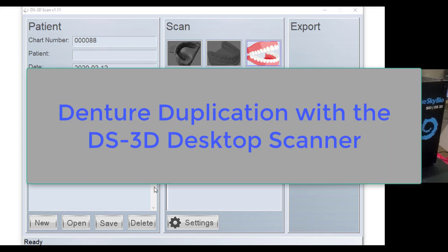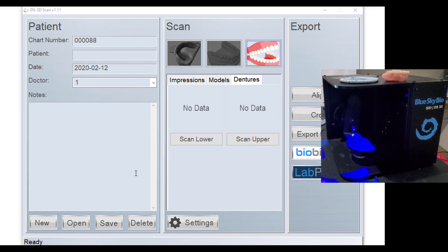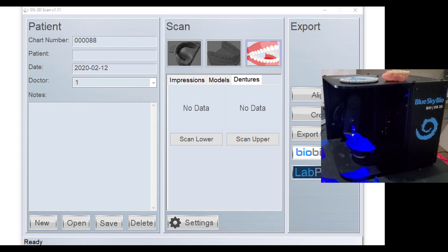Hey, this is Dr. Corey Glenn with Blue Sky Bio, and I'm going to be showing in this video the newest update to the DS3D software, and we've added the feature of denture scanning. And so let's go through in the software how to complete this.